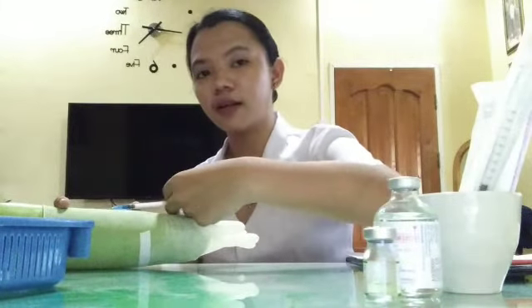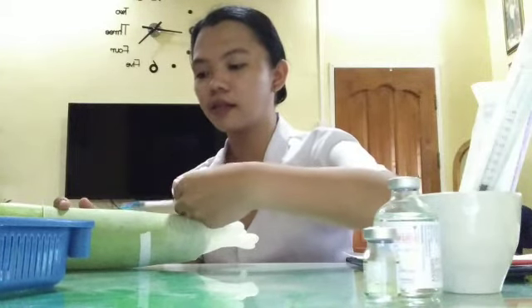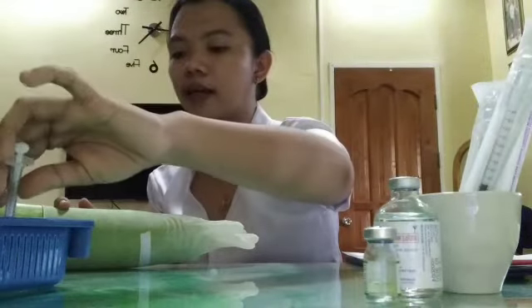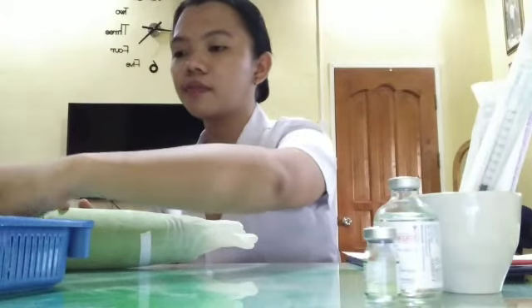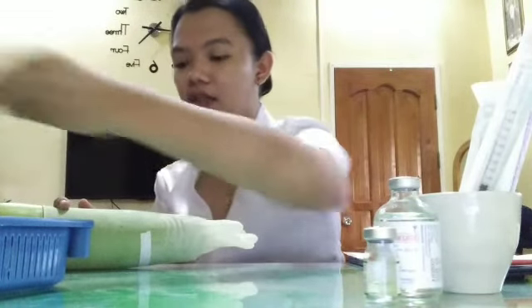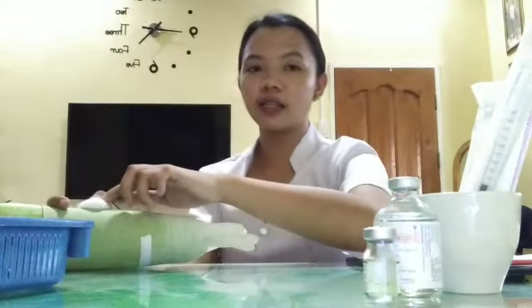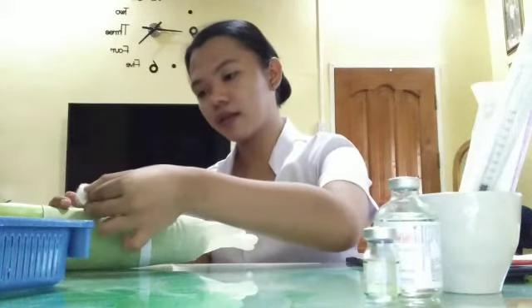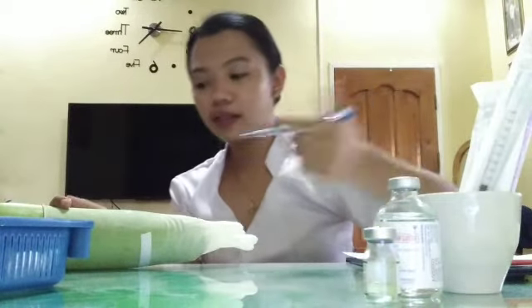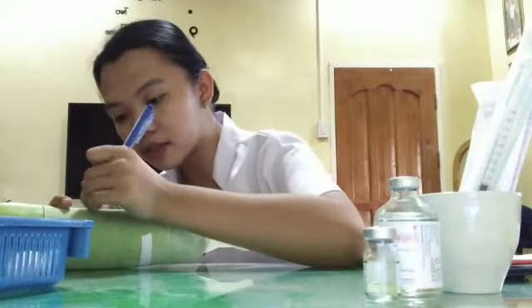So after administering, we withdraw the needle, and then put a dry cotton and put gentle pressure on it. Okay. And then encircle the wheal. So we will encircle the wheal.